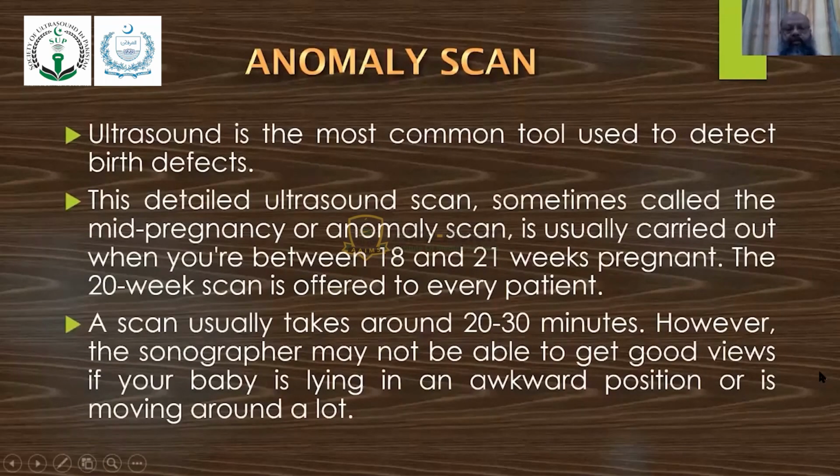Anomaly scan. Ultrasound is the most common tool used to detect birth defects. This detailed ultrasound scan, called the anomaly scan, sometimes called the mid-pregnancy scan, is usually carried out when you are between 18 to 21 weeks pregnant. "You" means the patient.